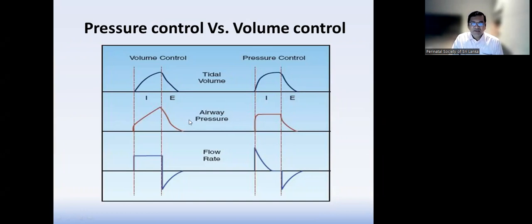මොකද එයාගේ pressure එක change වෙන එක pressure control එකේදී බොහොම ඉක්මනට pressure එක pip එක achieve කරනවා. pip එක achieve කරලා inspire time එක ඉවර වෙනකම්ම ඒ ගාන තියෙනවා. ඒක ලොකු pressure එකක් ළඟ ඇතුලේ තියෙනවා. volume control එකේදී වෙන්නේ inspire time එක දිගේම slowly තමයි pressure එක වැඩි. So drop is there. The flow is again something different with volume control and the pressure control.